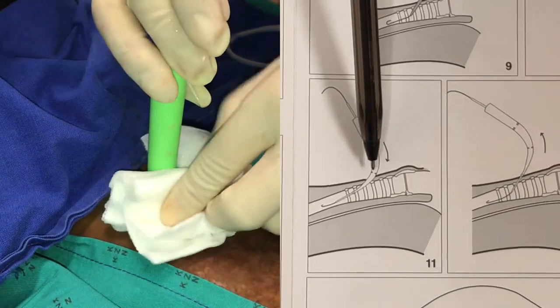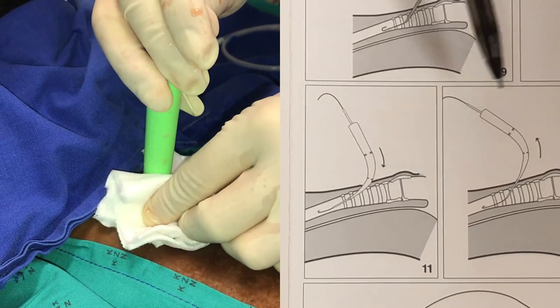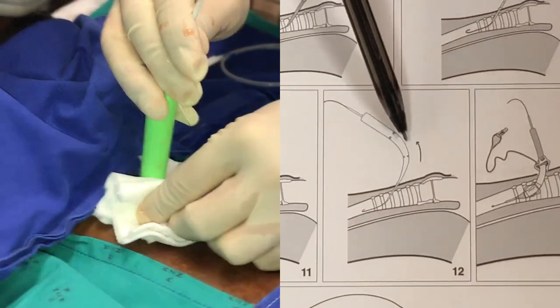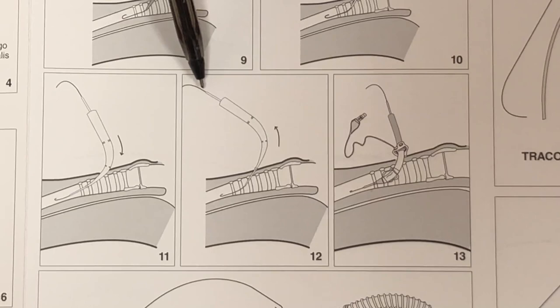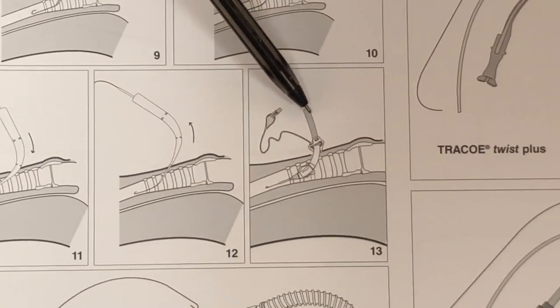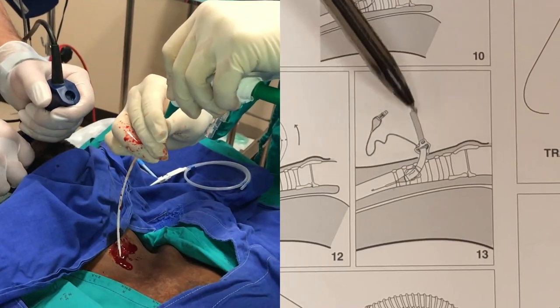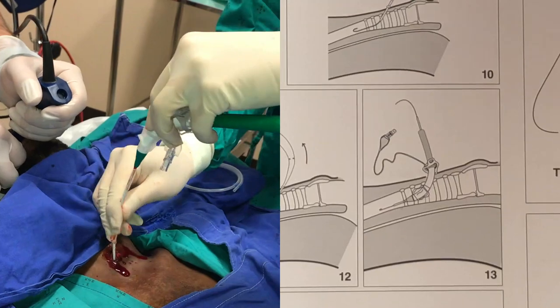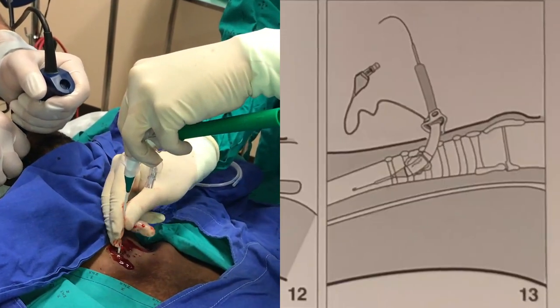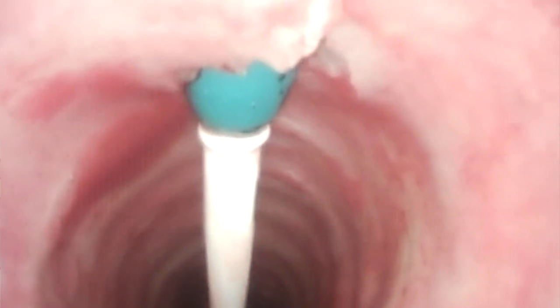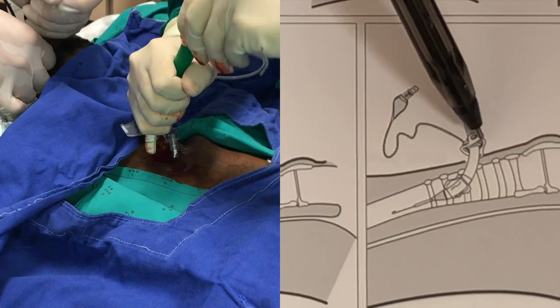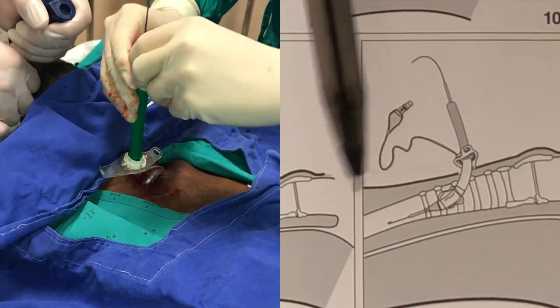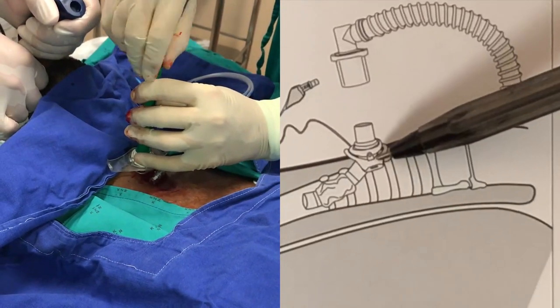Once you've inserted the green dilator, leave it there for about 30 seconds so the tissues can stretch. Then withdraw the green dilator, maintaining the guide wire and guide wire protector in situ. Thread the tracheostomy tube and its introducer over the guide wire and guide wire protector, and repeat exactly the same maneuver as you used for the green dilator. Once you've pushed it in, hold the tracheostomy tube by its flanges on the side.